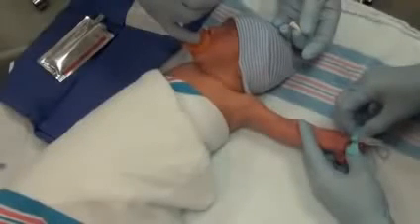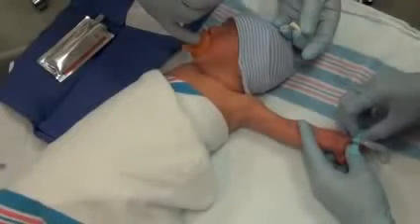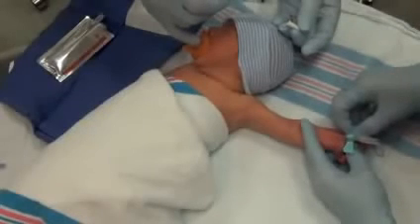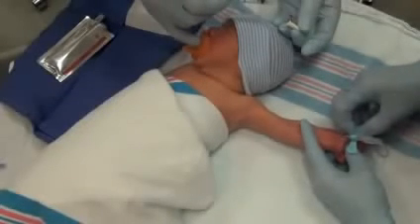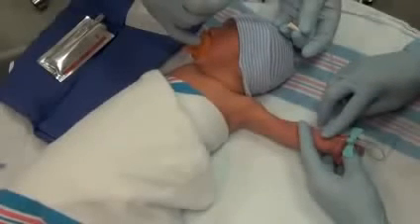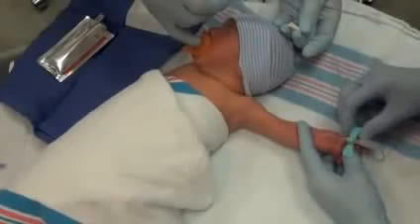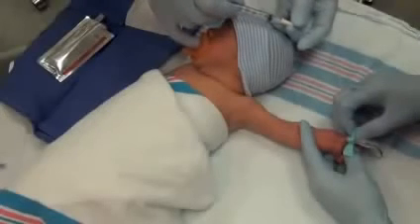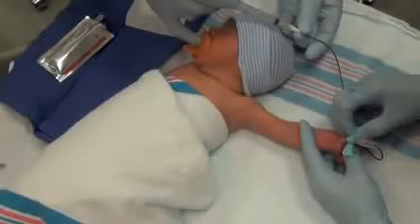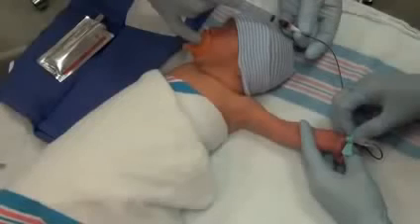If the initial puncture does not yield any blood, palpate the artery above the insertion site. Be careful not to contaminate the insertion site. Adjust the angle of the blood collection set until blood flow is achieved. Leave the end of the blood collection set open to air until blood is identified. Then place a syringe on the open end of the collection set and gently aspirate the required volume of blood.